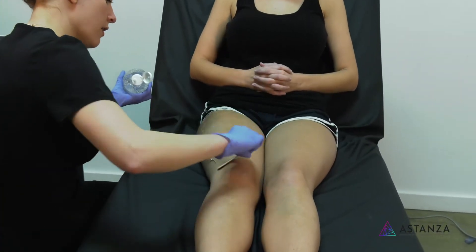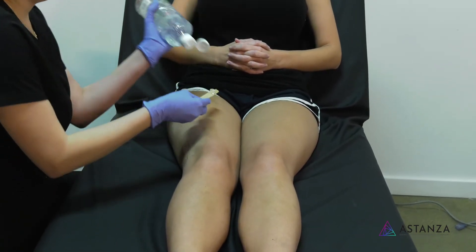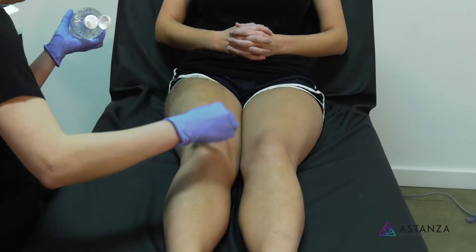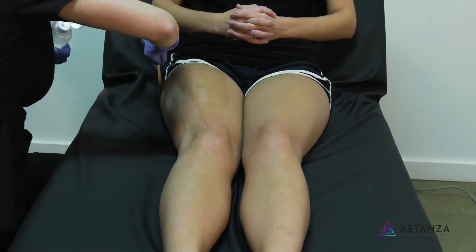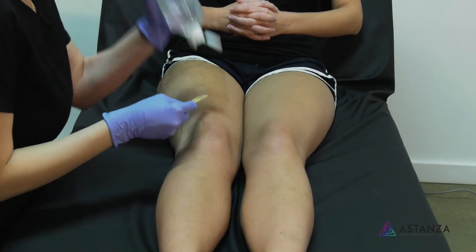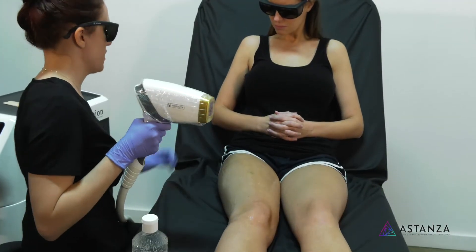The gel helps with movement — it helps the handpiece glide and also helps pull the energy into the skin. People either put too much or too little, but just a nice thin layer is ideal. Once you get going, for me, it's almost absorbed and dried out by the time I'm done. I just go where I'm going and the next place has a very fine layer. So I'm just going to do the top.